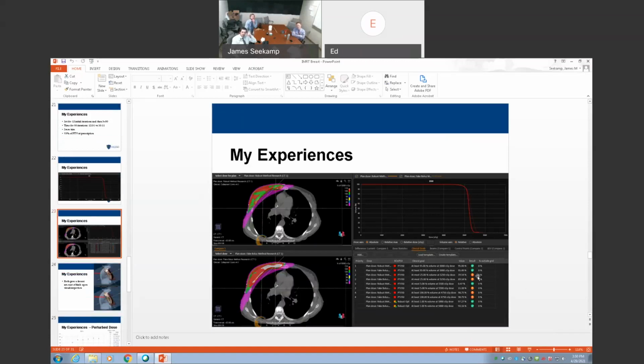Yeah. No, I never admit it. Yeah, I mean, what Jimmy did was a fair comparison, but there might be some additional tricks that we know you have to do with the bolus plan, some final optimization, because we would probably not accept that one plan with the 10%.